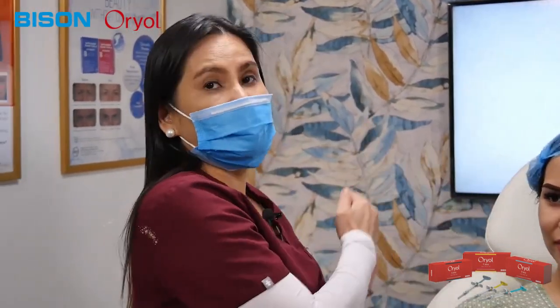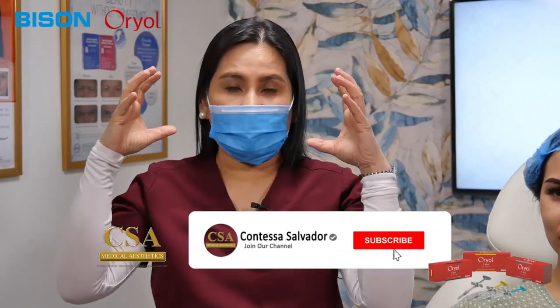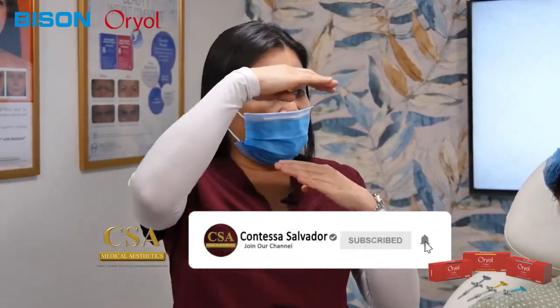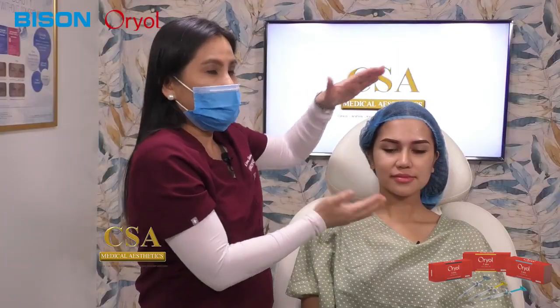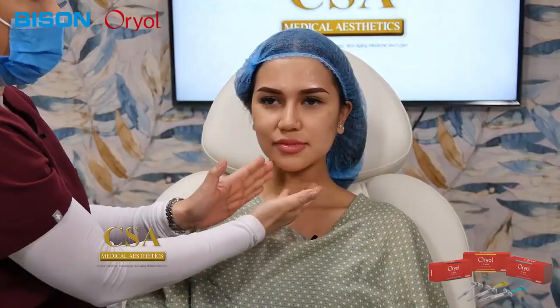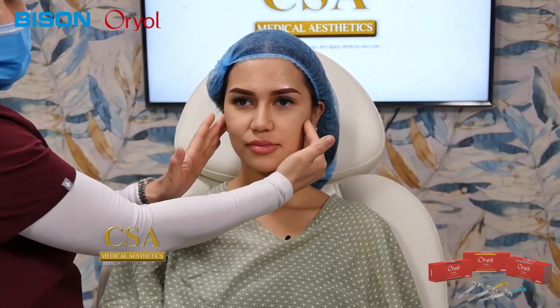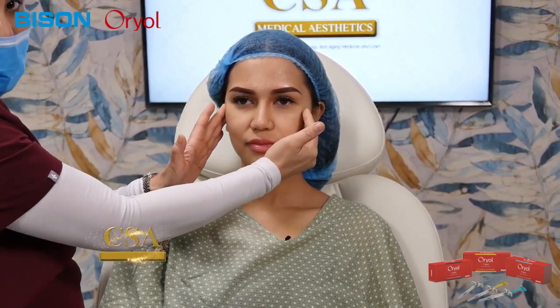And another thing, because her face is more of the Caucasian side, okay? Because Asian women, we have this rounded shaped face or a shorter face and a wider face. Caucasians, they have an elongated and a narrower face. So I'm looking at Kim, so she's more on the Caucasian side. For the Caucasian shaped face, elongated and narrower, it's important that we correct this lateral aspect of the face. So from temple to the zygoma region.